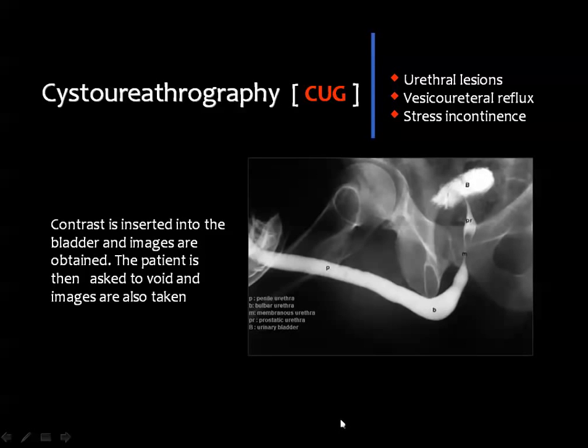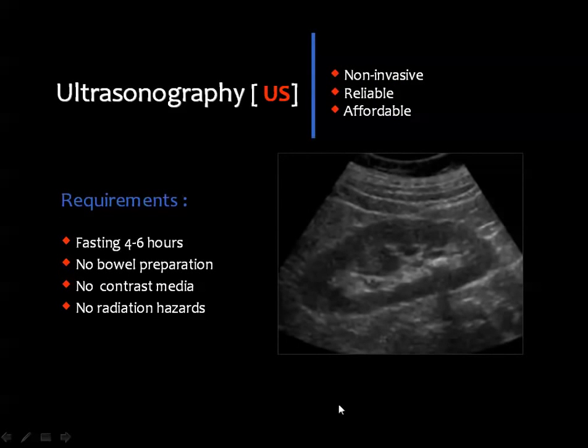Ultrasound is one of the valuable methods for assessment of the kidney and urinary bladder. The examination of the ultrasound is relatively non-invasive. It is very reliable and less expensive compared to other imaging techniques.